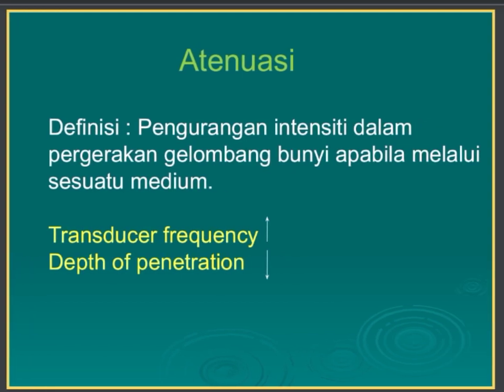Okey, seterusnya kita pergi kepada atenuasi, iaitu pengurangan intensiti dalam pergerakan gelombang bunyi apabila melalui sesuatu medium. Okey, contohnya apabila kita menggunakan transducer berfrekuensi tinggi, maka apabila gelombang bunyi itu melalui medium, sedikit sebanyak tenaga itu akan berkurangan dan boleh mengurangkan kedalaman penembusan gelombang tersebut pada sesuatu medium, ya.